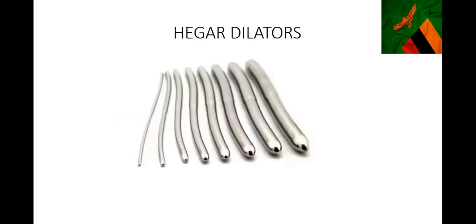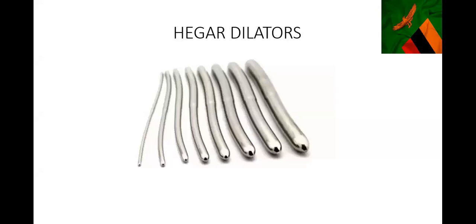These are Hegar dilators, used to dilate the cervix when you want to access the uterus but the cervix is closed. You go from the smallest one - about size three - up to the biggest one. These are Hegar dilators. For medical students, when you say 'dilators' that's adequate as well.